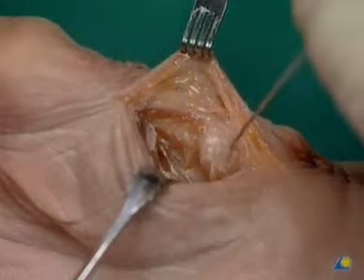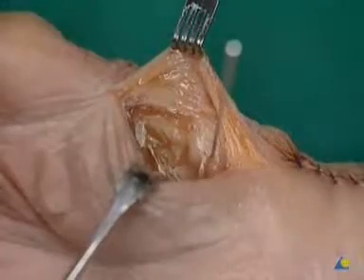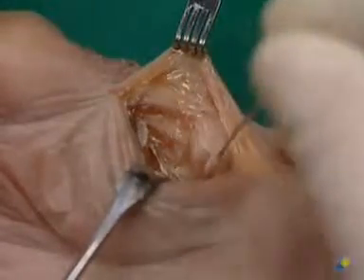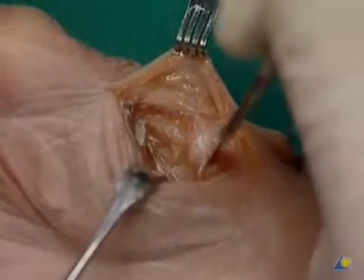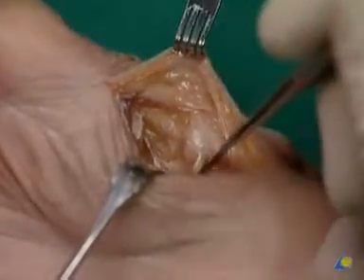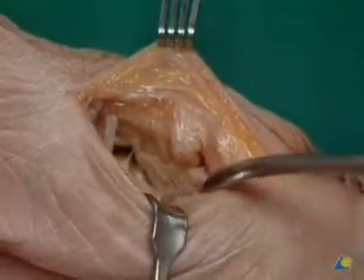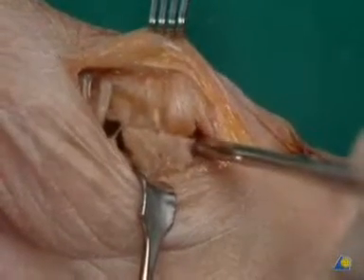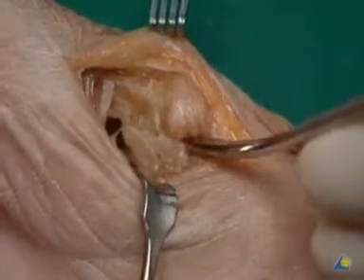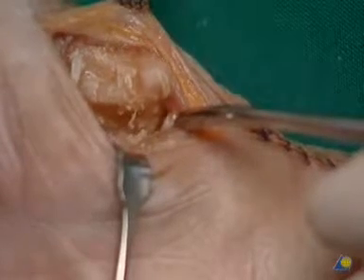A Kirschner wire is used to mark the saddle joint. The joint capsule is opened with the scalpel. Care must be taken not to detach the stabilizing ligaments from the Bennett's fragment. The rotation of the metacarpal one and manipulations with the periosteal elevator will open up the fracture and reveal the involvement of the joint from palmar.